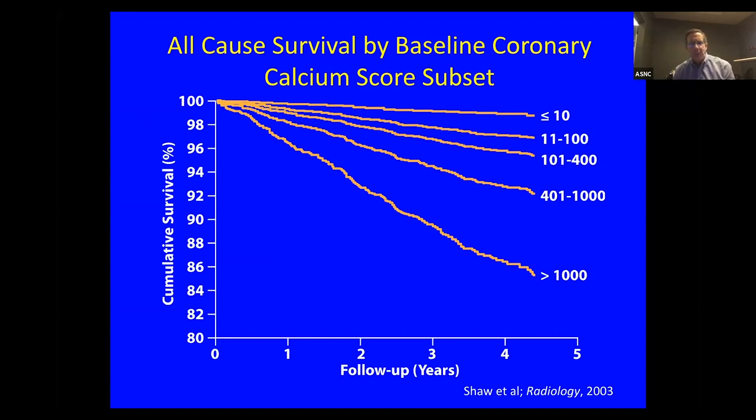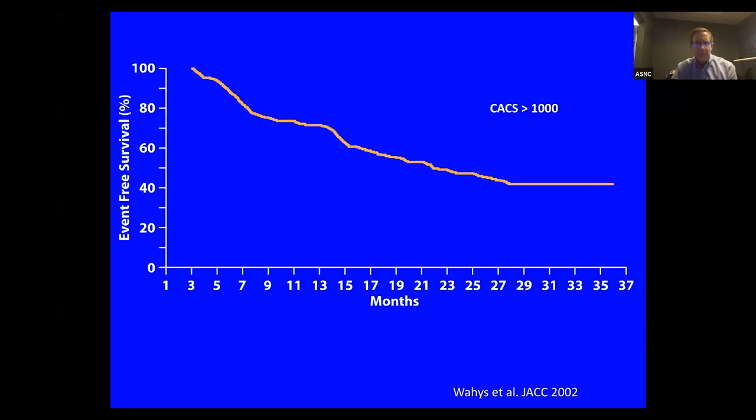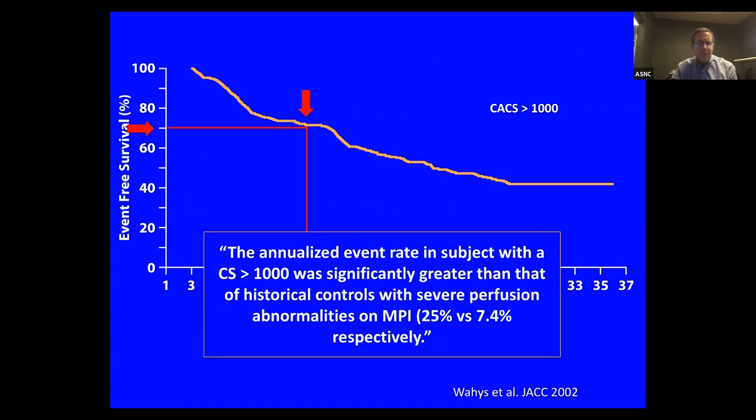with high coronary calcium scores, the all-cause event goes up. Here is 1,000, as you see, from a well-traveled slide from Leslie Shaw. This fellow had a calcium score of 3,000. Here's one study that's a bit old, but is rather striking, that for patients who had a calcium score of over 1,000, who came into the hospital, the event rate, MI or death or need for urgent revascularization was 25% at 1 year, so really quite high. So again, this patient should not have been treated like he was fine.